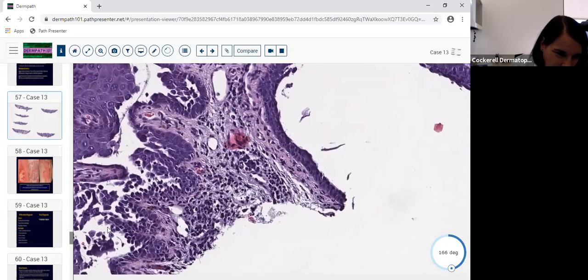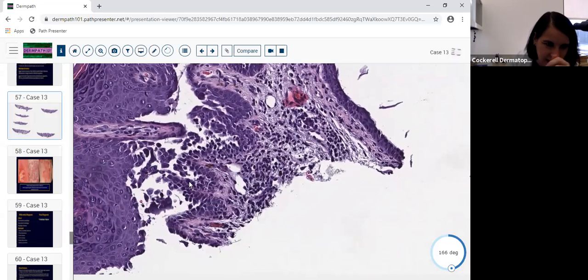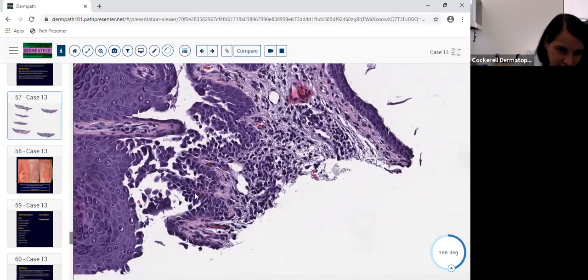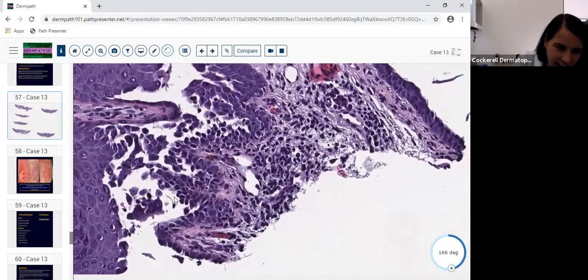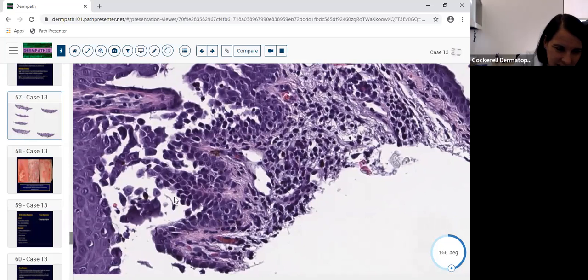And then some may argue, oh, wow, I think I see acantholysis. You're seeing separation of the keratinocytes. I really want you to study this because the next case that we'll be looking at, we can really discuss this whole term acantholysis. But here you're seeing a little bit of white in between the cells, and you're seeing separation. The intercellular bridges are gone, and the cells are separating. Take a quick look at it and just say, hey, I don't see any multinucleation or ground glass inclusions or margination of the chromatin or ballooning degeneration. So it's not herpes. So at least get that out of your head.